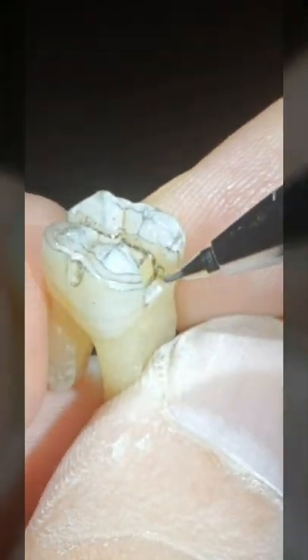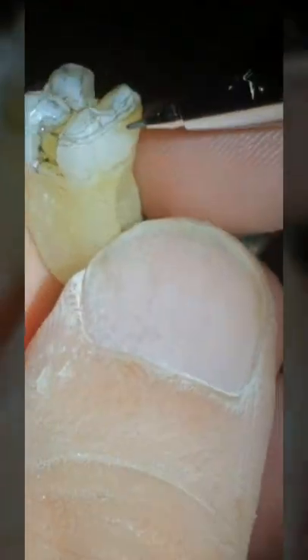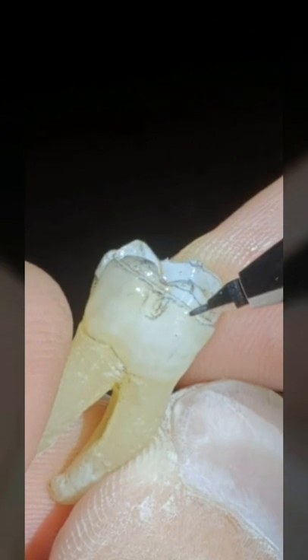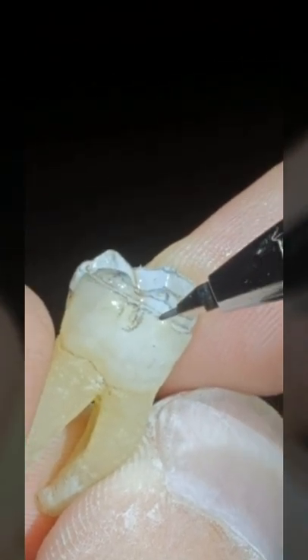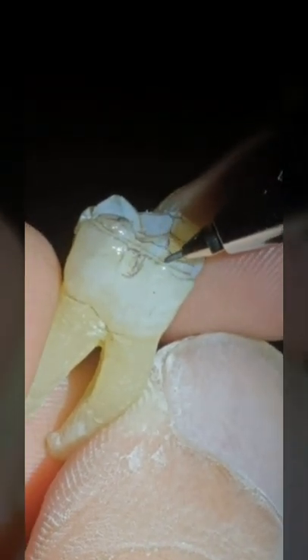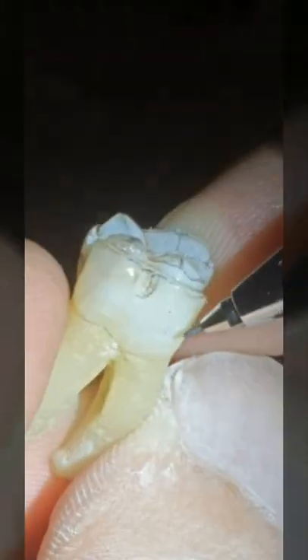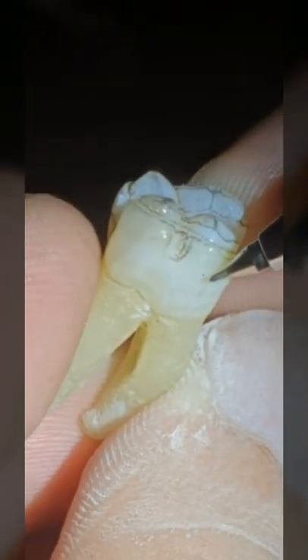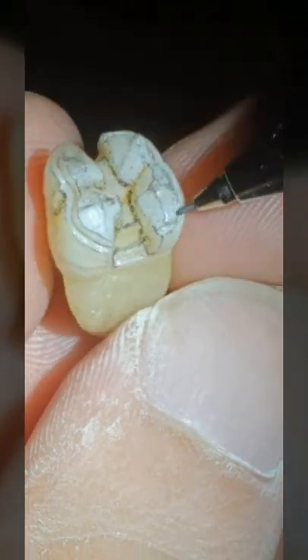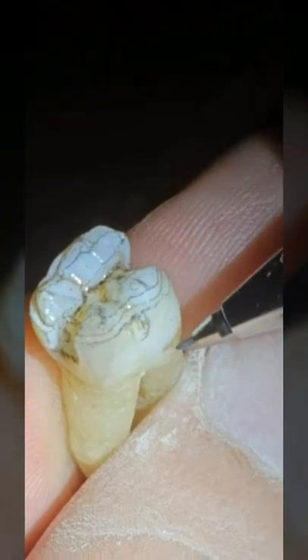Now we will take this and change it into a 3/4 crown. In a 3/4 crown I would cover this aspect completely, and the facial would be kept clean. This used to be a technique used when we had no ceramics to cover the tooth with, and the restorations we had available were metal restorations. And to keep the buccal surface clean in the smile, we would cover the lingual as a 3/4 or 75% of the tooth was covered with it, and 25% of the tooth was remaining.